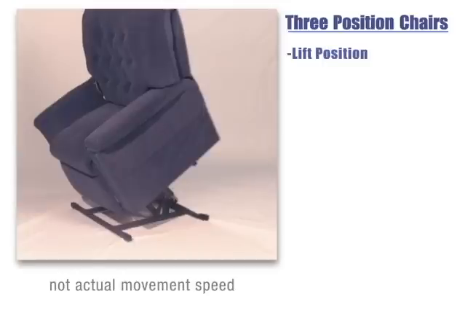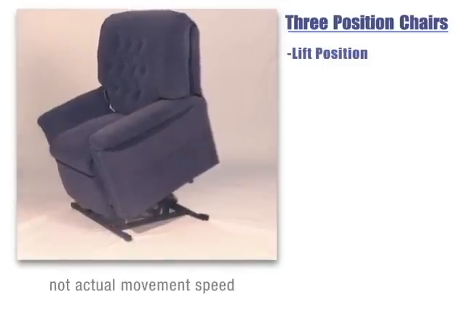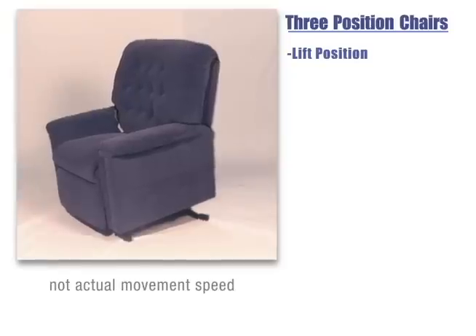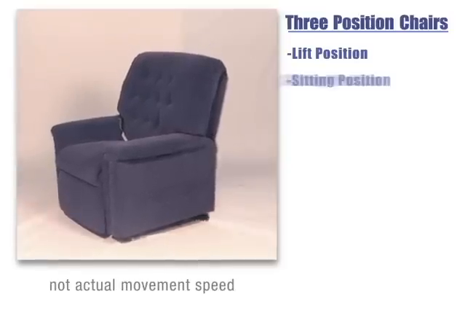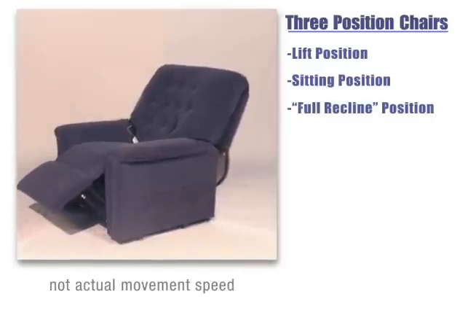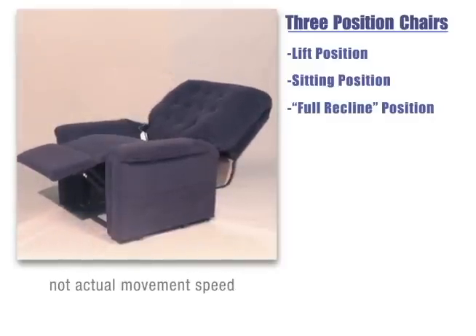The three position chair is able to reach all of the same positions as the two position chair. However, it's also able to recline to a deeper angle, making it perfect for reading, watching TV, relaxing, or the occasional nap.